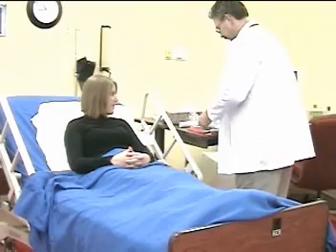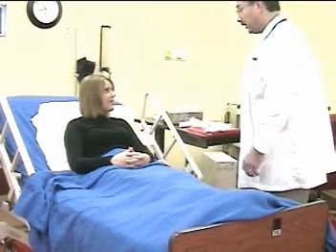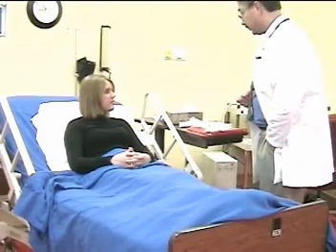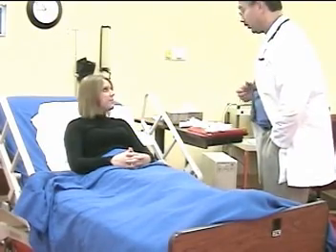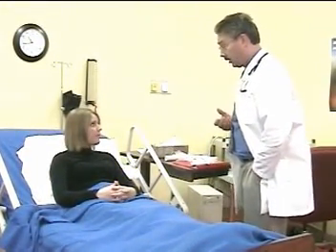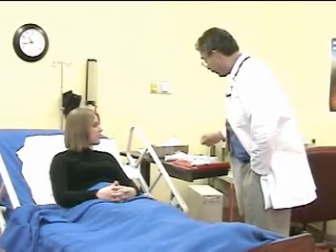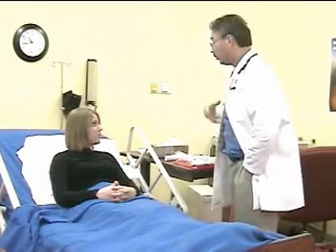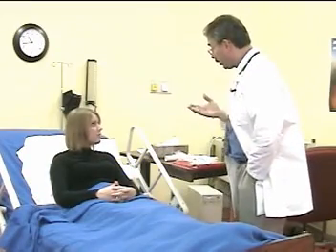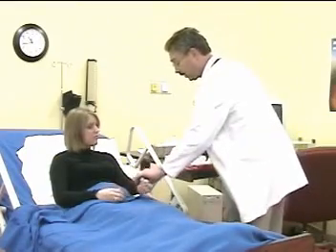The therapist monitors the patient before therapy. Hello Michelle, my name is Dave Zovec, I'm a respiratory therapist. I'm here to give you a breathing treatment. What I'm going to be doing is using a device called a nebulizer to make a liquid medication into a mist that you'll inhale into your lungs. This medication is a bronchodilator, which will open your lungs up to help your asthma condition. Before I start, I'd like to take your pulse and listen to your breath sounds.